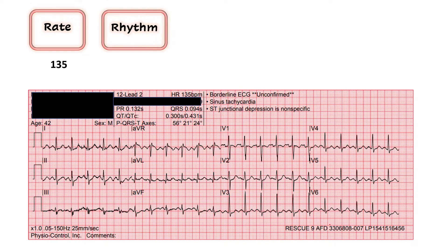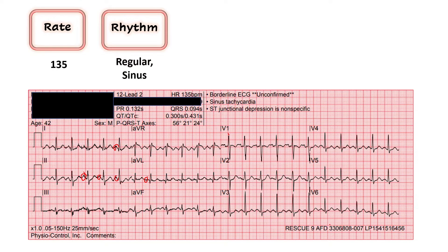We'll go with 135 for our rate. For rhythm, the next question is: is there a P wave before every QRS — is this a sinus rhythm? My favorite place to look is lead two. I do see a P wave before every QRS, so I would call this a sinus rhythm. The complexes also seem to be pretty evenly spaced, so I would call this a regular sinus rhythm.